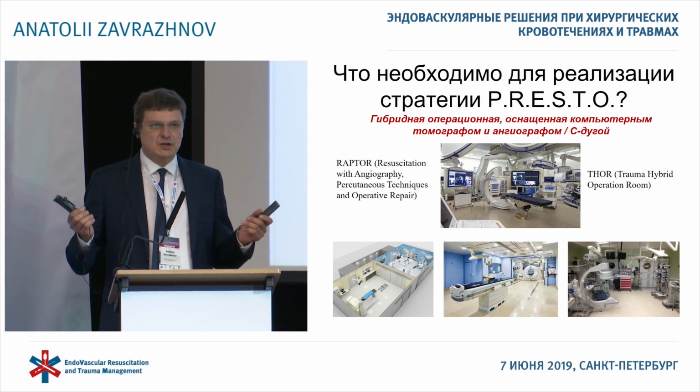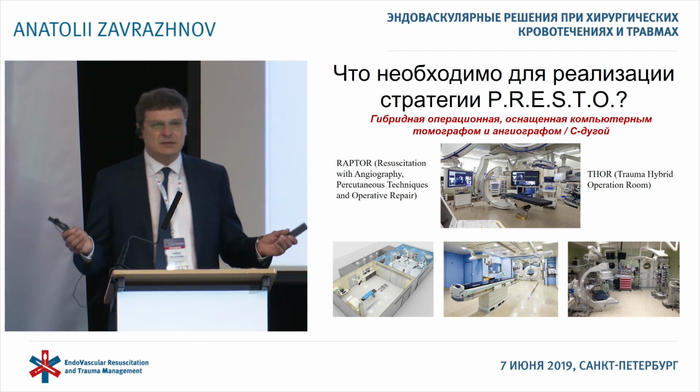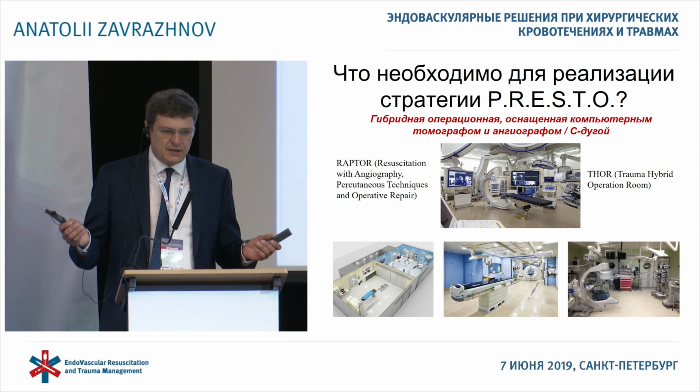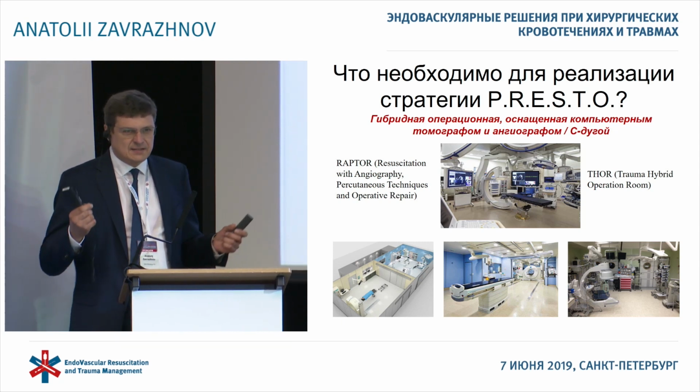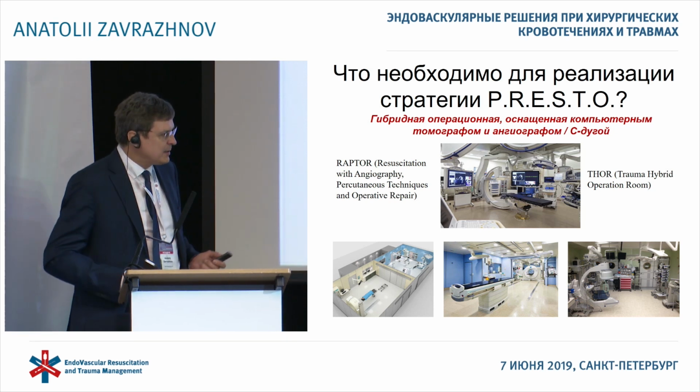We learned that in order to implement the Presto concept, we need a hybrid OR. A hybrid OR combines not only open surgery techniques, but also an angiographer and a CT scanner.